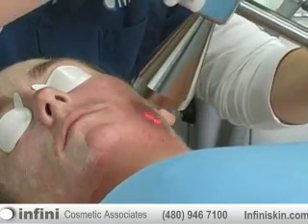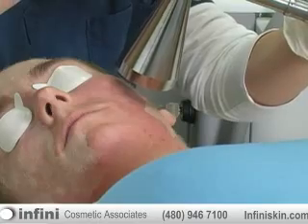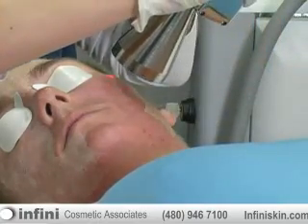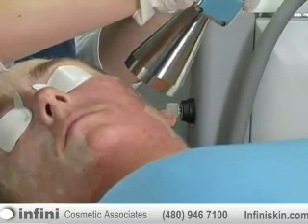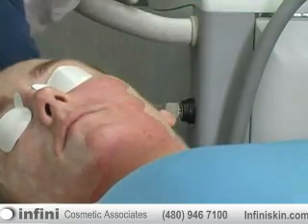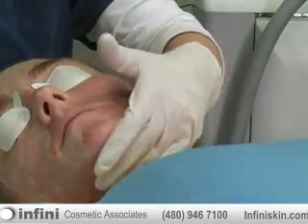We do use a smoke evacuator when we do this treatment. The smoke plumes that are generated from burning that skin off are just sucked up in a little sterile filter on a smoke evacuator. The procedure is actually very quick, and believe it or not, with that low level of resurfacing, it's extremely comfortable.